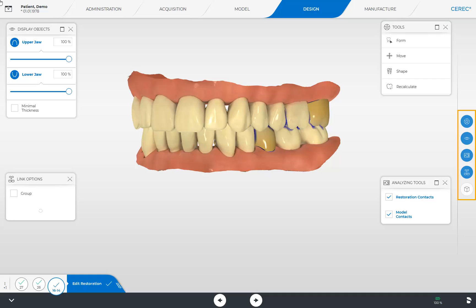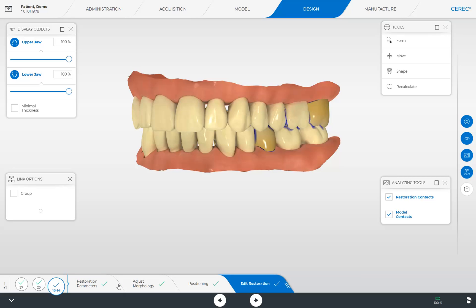In the design phase, we not only have a side panel but also a step menu, which is currently minimized. To display the full view, we tap the two parallel lines at the end of the step menu. Now we can access the steps Restoration Parameters, Adjust Morphology, Positioning, and Edit Restoration — the step we are currently in. These steps are optional, and therefore they already have green checkmarks.